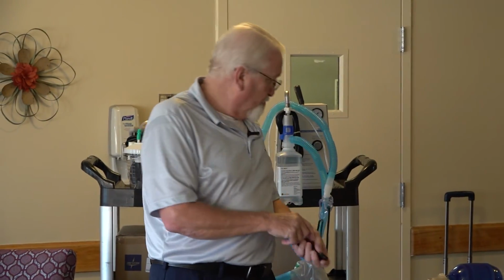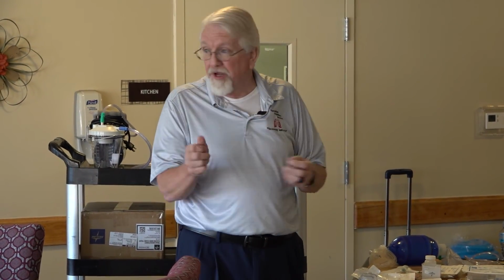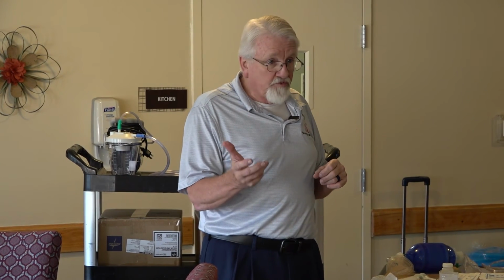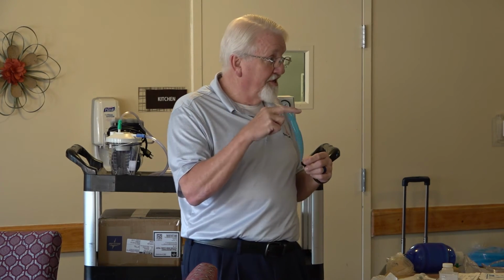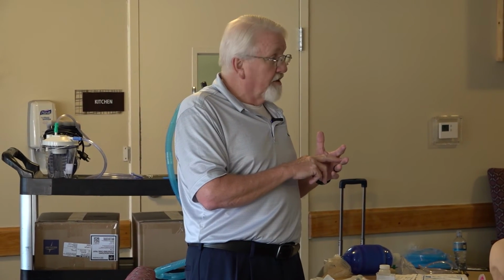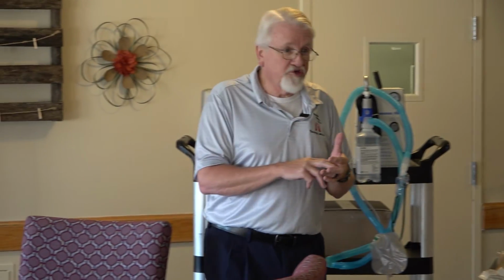So your first process is going to be removing that little rubber seal. When you do, it's going to have a washer attached to it. And you're going to have your regulator. Your regulator is going to have 2 pins in it that are designed to match the pins on the head of the cylinder. That little washer's got to be in there, and it has to be in there correctly. I'm sure you folks have been down that road before. The washer's not been right.